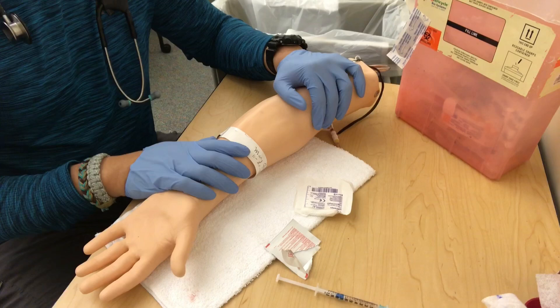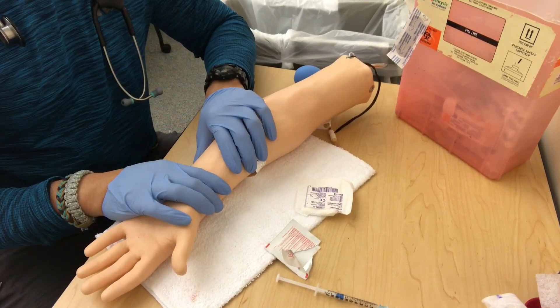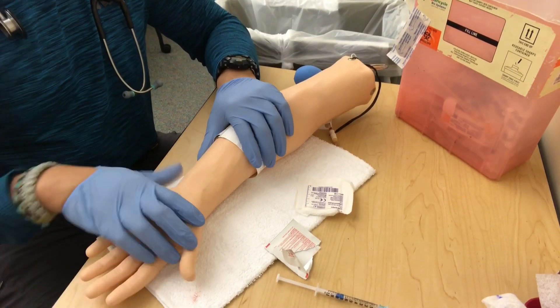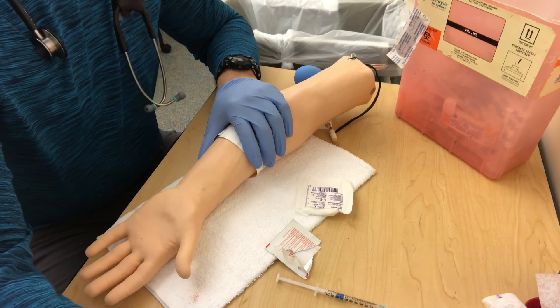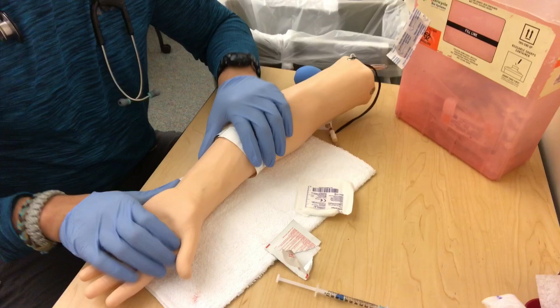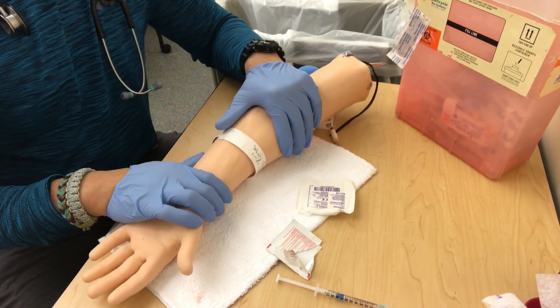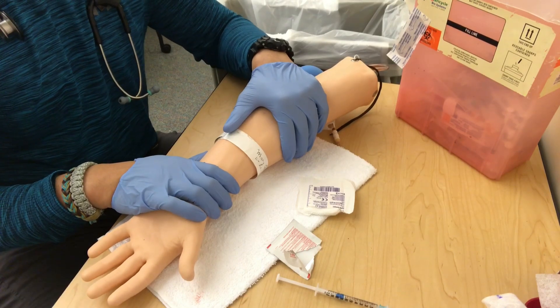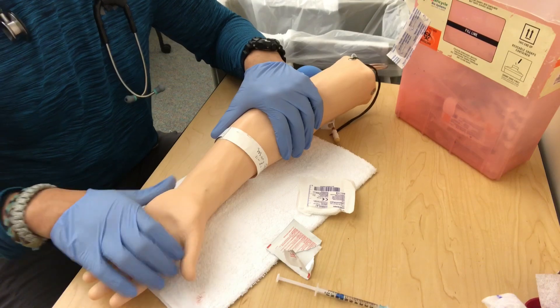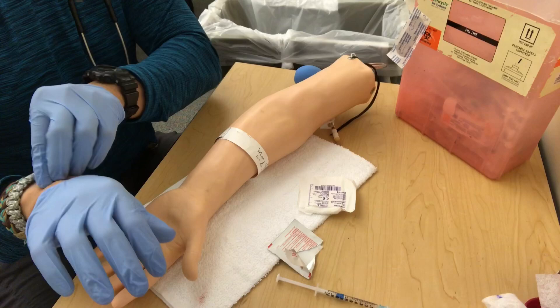I've already explained the procedure to this patient and checked the arm band to make sure they're the right patient. The first thing I'm going to do, textbook, is an Allen's test. The Allen's test is controversial — it's not something you'll probably see a lot, but it's good to know. It is something governing bodies want us to do, and we chart that we do it. A lot of our patients are vented and can't cooperate, because the Allen's test requires cooperation.